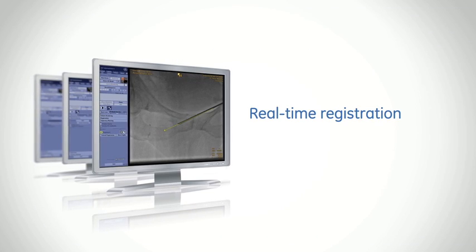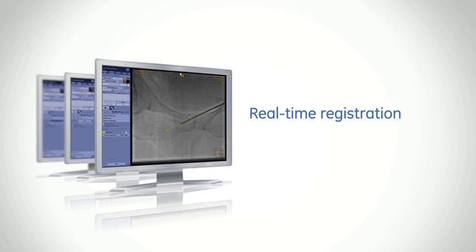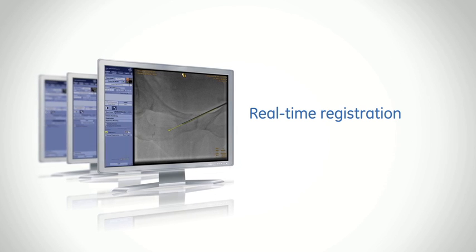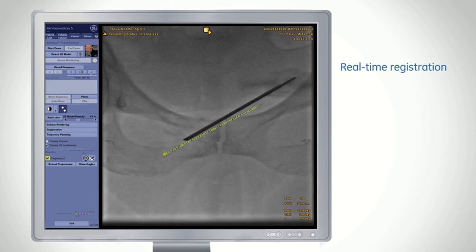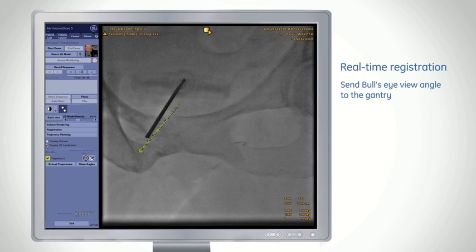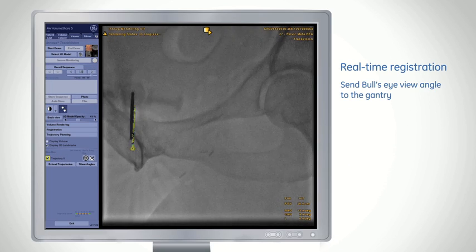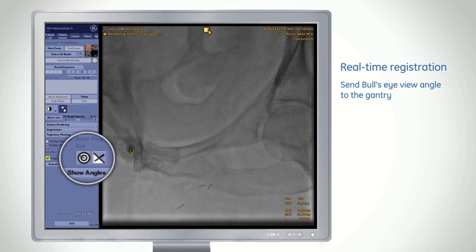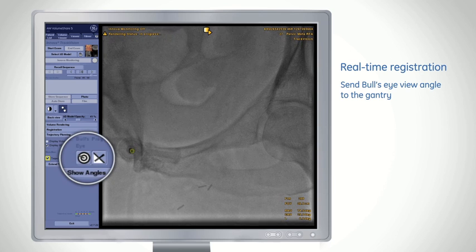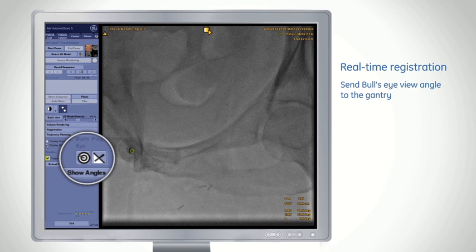Fused 3D trajectory models are adjusted to C-arm angulations and table motion to support confident registration throughout the procedure. The bullseye view angle is automatically computed and can be sent at any time to the gantry.